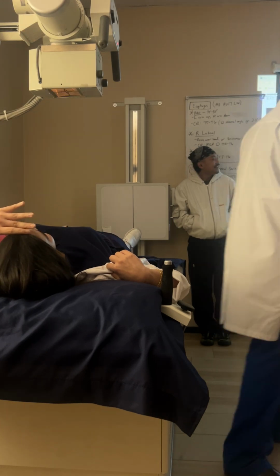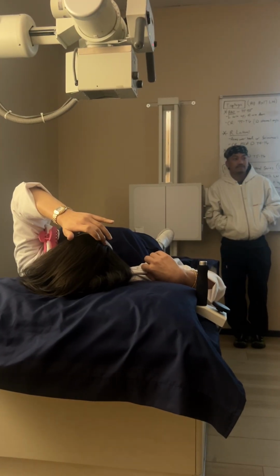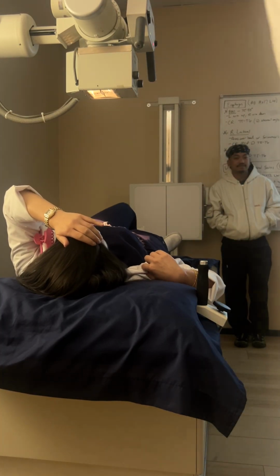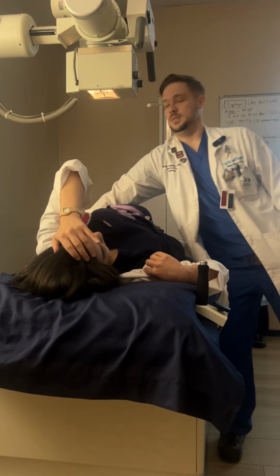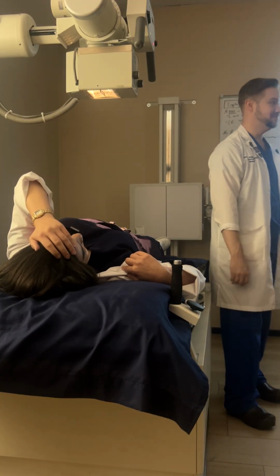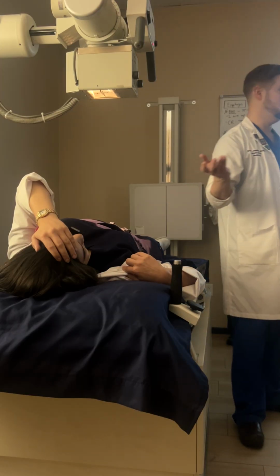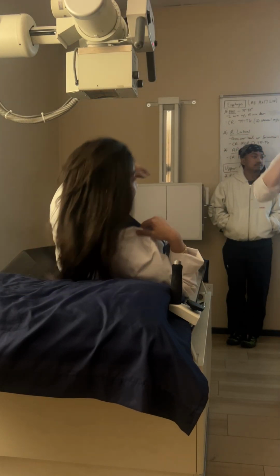Okay, lower GI. Let's start out with the AP and the RPO. AP. Oh my God, so hard. RPO. That's at the iliac crest still, right? Mm-hmm. And then LPO would be the same thing, other side. RAO, same thing. Just PA. Watch your head.